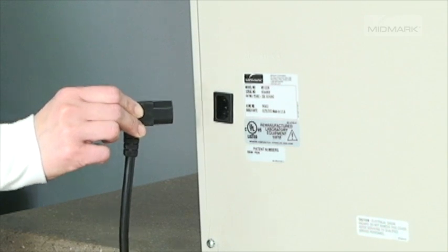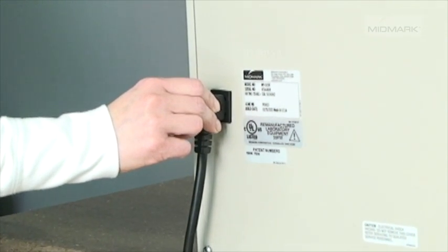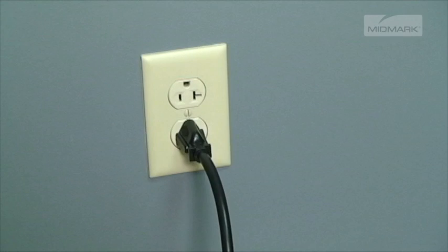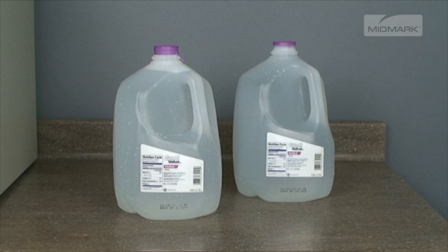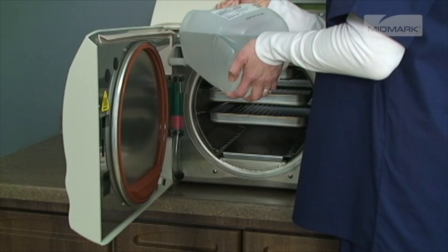After ensuring proper electrical requirements, attach the electrical cord to the back of the autoclave and then into the wall socket. Now you will want to fill the reservoir with clean, distilled water. It is very important that only distilled water be used.